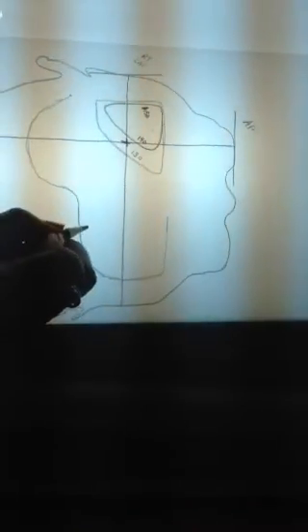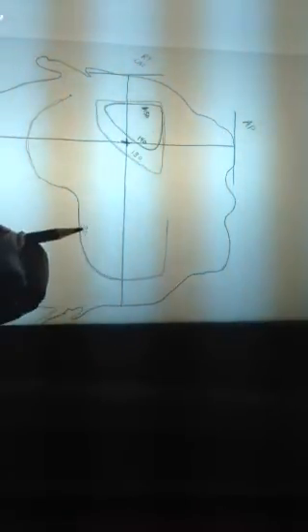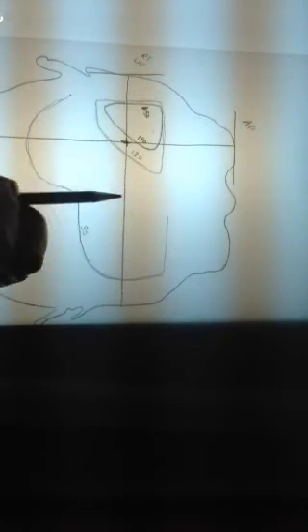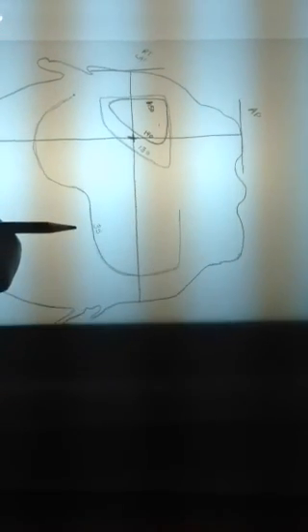Okay, so here's 35%. And of course, between 35% and 130%, there are many dose lines, and you're going to find out what those are depending on the beam arrangement. Hope this is helpful.